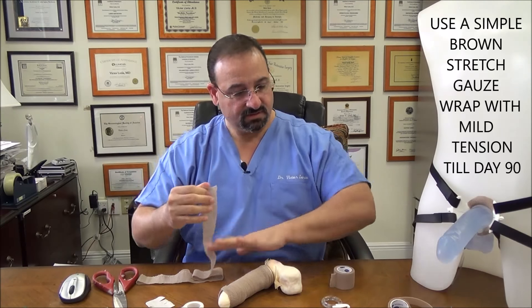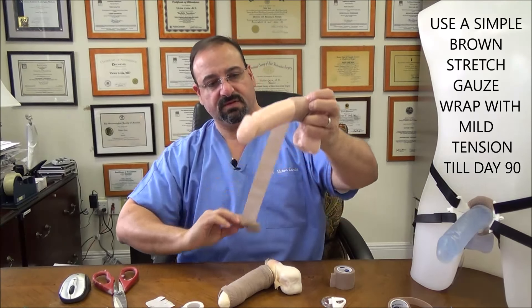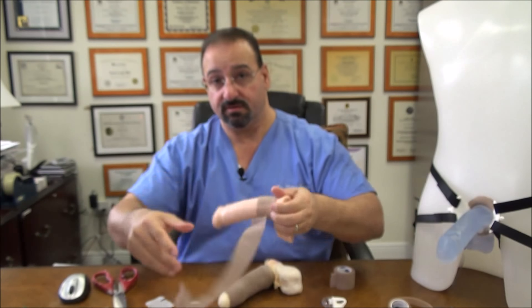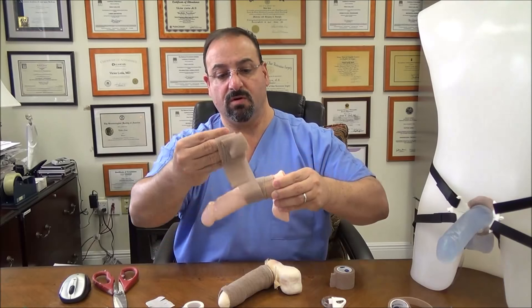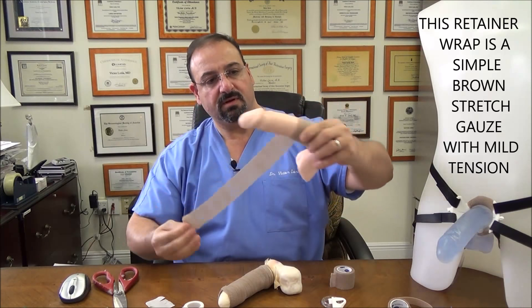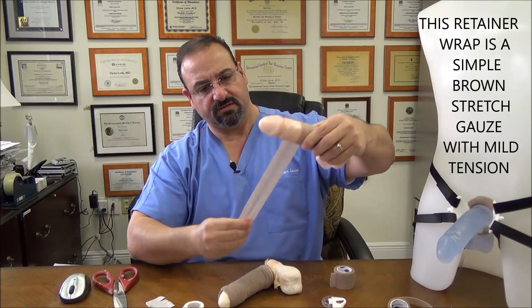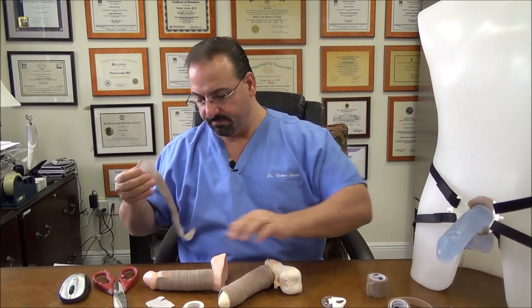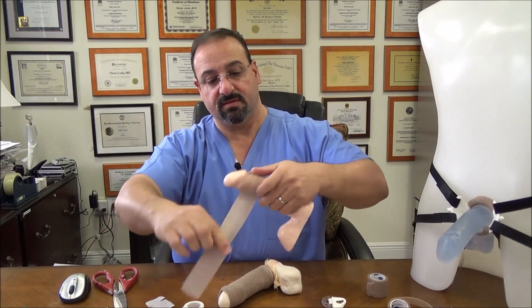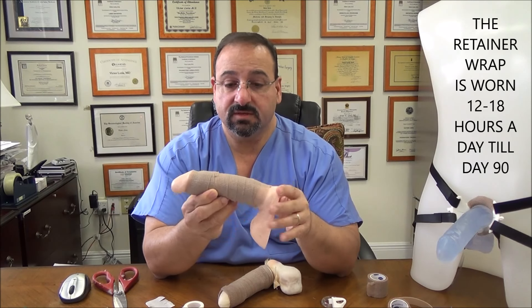For example on day 21 you take everything off and all you do is very simple — you start at the base with very light tension, overlapping. If your erections are longer you overlap more. This is the retainer wrap — just a simple brown stretch gauze. Continue with mild tension all the way, going under the glans just like that, and drop down. That is the retainer wrap. You wear this 12 to 18 hours a day until day 90.